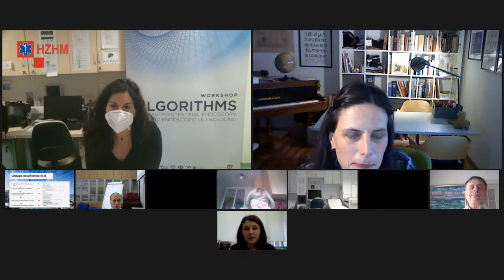Da, što se tiče solidnih katetera, oni su ipak za stariju dob, nekako uzmemo tu 7. ili 8. godinu, nekakvu prijelaznu dob kad bi to moglo funkcionirati kao i kod odraslih. Mi solidni kateter nemamo, ja sam solidni kateter vidjela samo u Londonu tijekom edukacije, gdje su ga radili kod svoje djece. Mi smo nabavili vodopropusni kateter, oni su mi savjetovali da ipak to bude prvo vodopropusni kateter, da se nekako suživimo s njim, pa onda ako bude mogućnosti da se pređe i na solidni. Moje iskustvo za sad u obavljanju manometrija jednjaka je oskudno, budući da je tek napravljeno njih nekoliko.